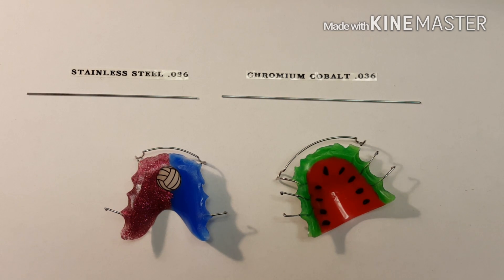Hi, this is Steve Zara from Zara Dental Lab. In this video, I'm going to demonstrate the difference between a stainless steel wire and chromium cobalt wire, and the differences in versatility.